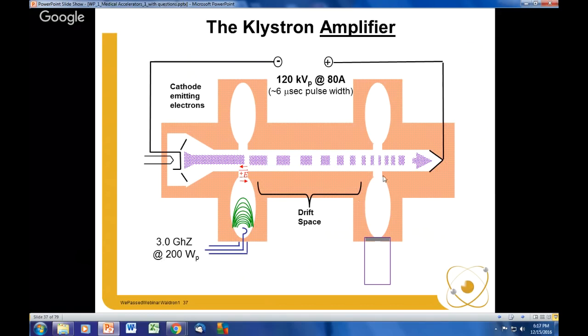And now what I've got is a gap here with a very large charge passing it. So as that charge passes this gap, it's going to interact with electrons near the surface of this conductor, forcing them counterclockwise and clockwise within this cavity. They're going to rotate back and forth, just a few charges. And they're going to do so sinusoidally as a result of the sinusoidally varying charge density passing this gap. This is going to induce a rather large electromagnetic field in this resonant cavity.